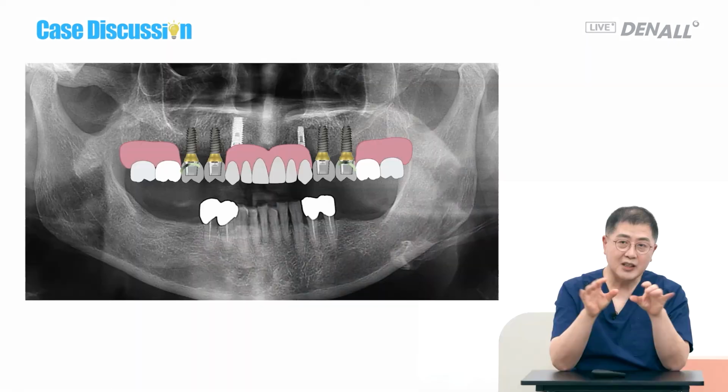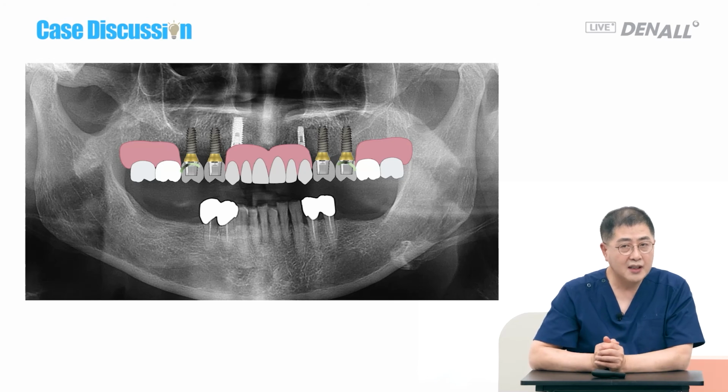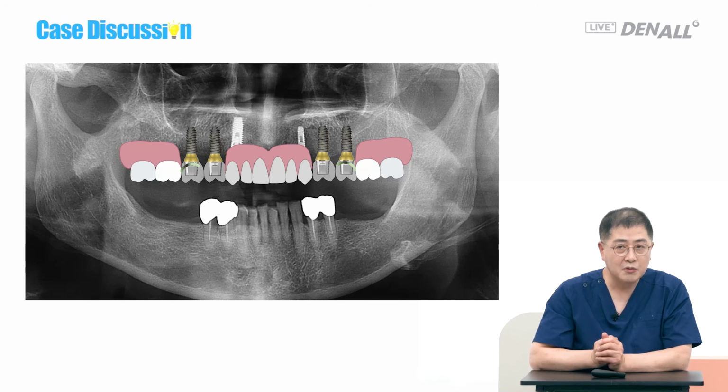Natural teeth have a periodontal ligament which moves just a little bit to accommodate the errors in the RPD, but implants don't move. Therefore, if the RPD does not fit perfectly, it will be a problem. Impression taking is a little bit tricky because there are many undercuts. So we cannot apply this procedure to a site where extraction was made a long time ago. It's difficult to make the surveyed crown.